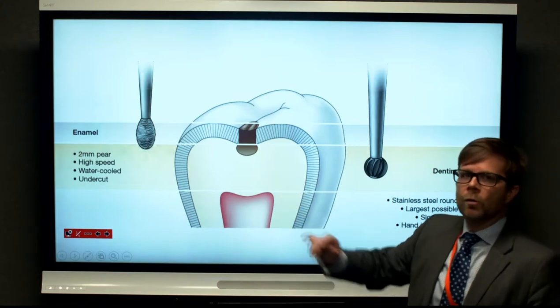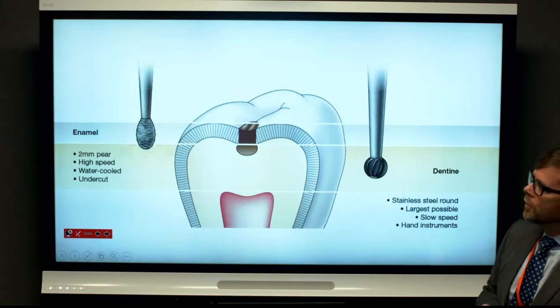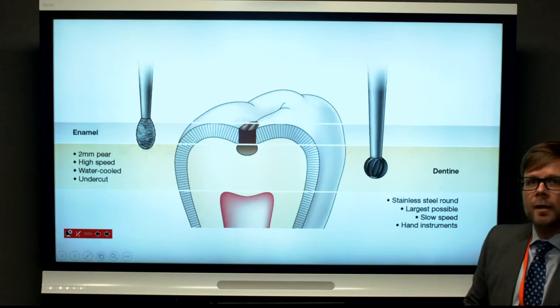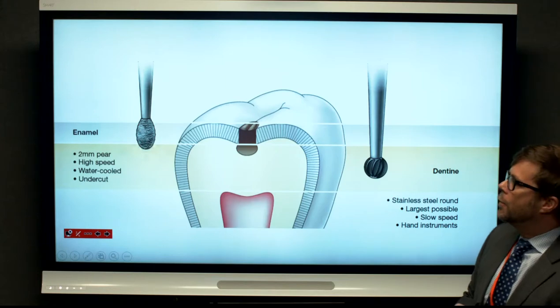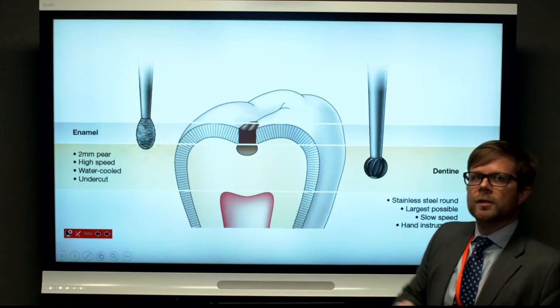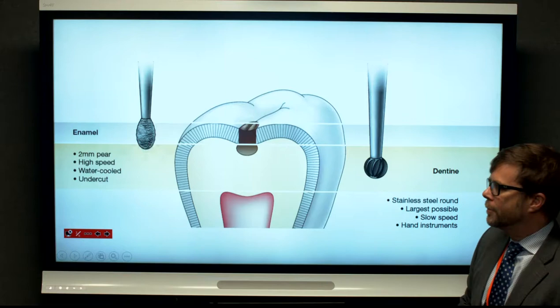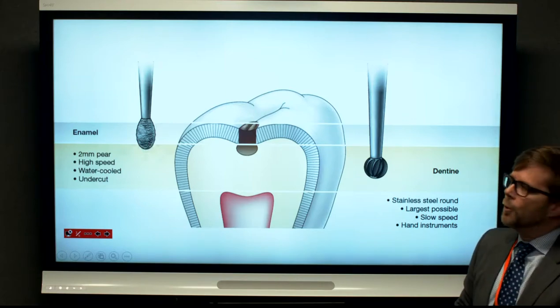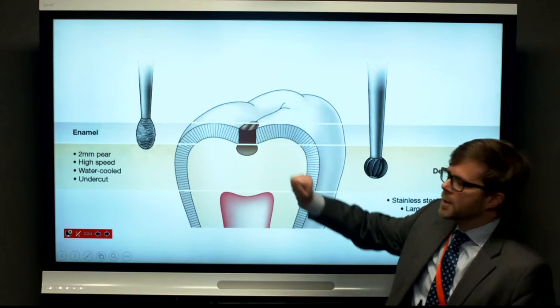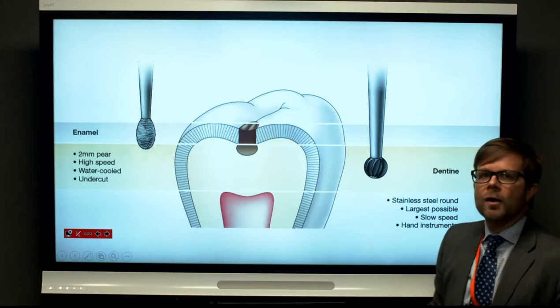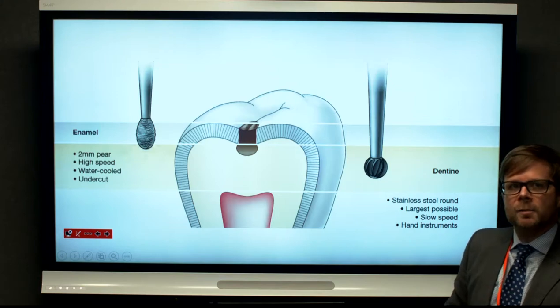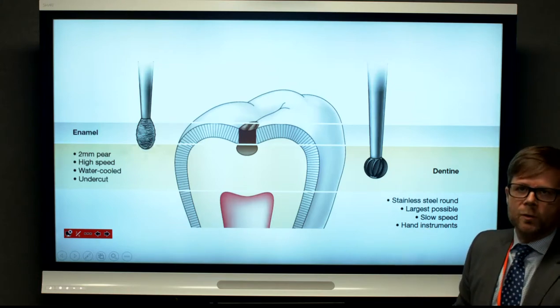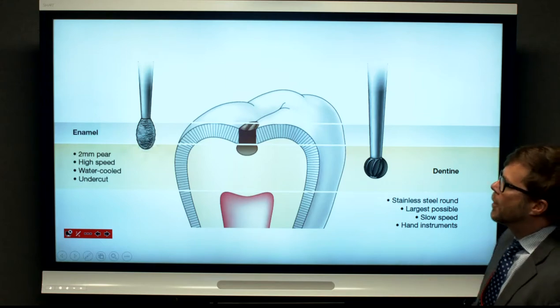Just to recall, we have the high speed handpiece with high speed burrs. They can be diamond grit covered or tungsten carbide burrs, and their job chiefly is to remove enamel or to cut through enamel. Enamel is the hardest substance in the body, so it needs the high speed handpiece run at high speed, water cooled to prevent friction, and the diamond grit or tungsten carbide to cut efficiently through enamel.